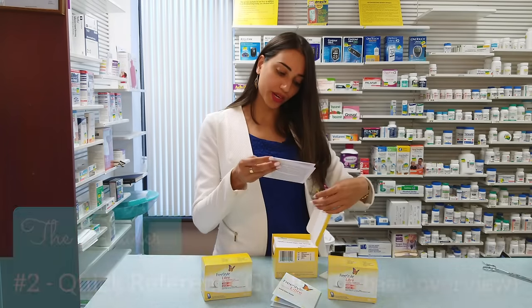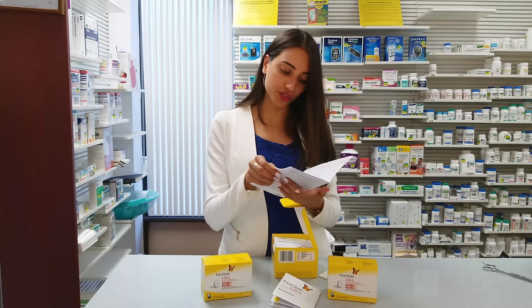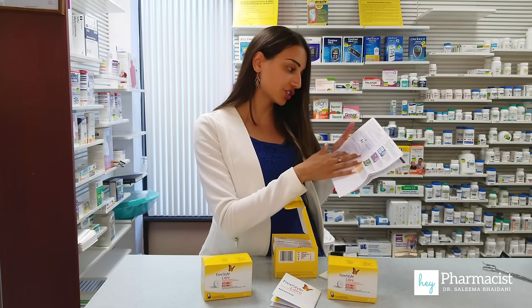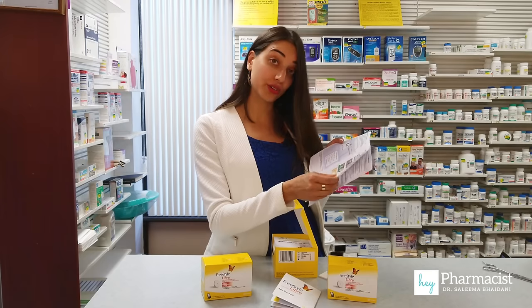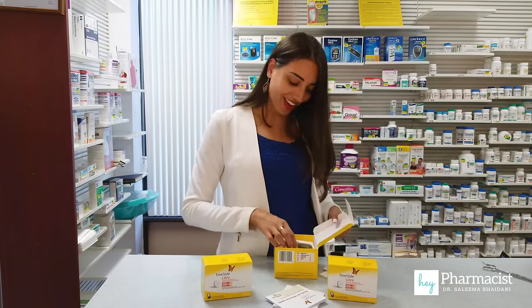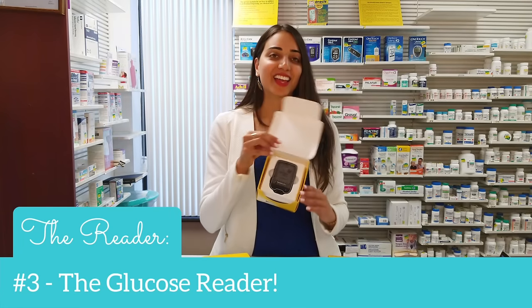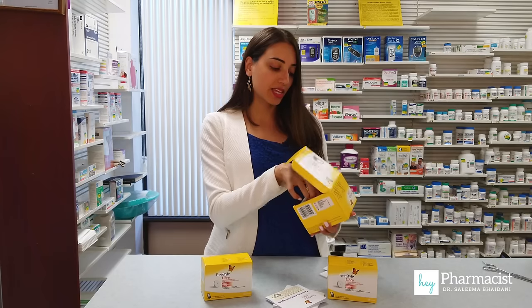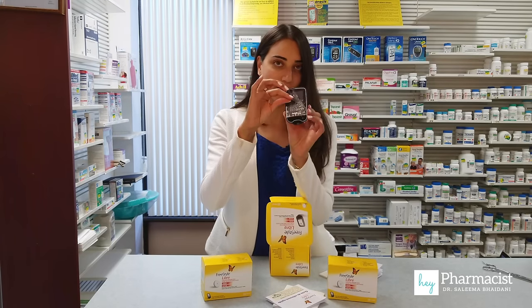The next is a quick reference guide with indications for use, contraindications, cautions, understanding the glucose readings, when to do a glucose test — lots of different nice pictures and stuff like that. So that's really nice and then here we go — there's the device. We've got this all sealed up. I'm going to take this off so we can have a better look at it.